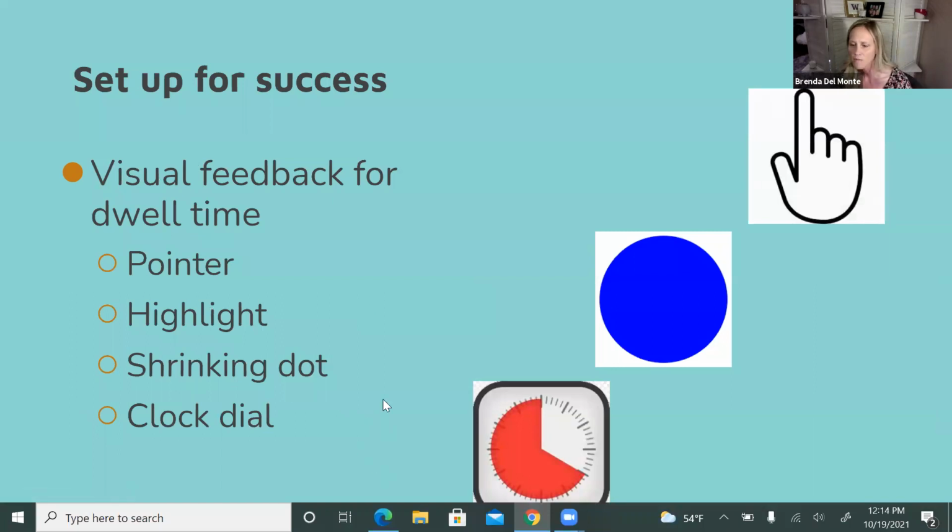Okay, so this device is programmed for eye gaze, the Accent, or is the eye gaze something that you added? Same for the Dynavox. For both of them, they were ordered with the eye gaze cameras installed. It's just like a Tobii Dynavox, but you have to order it with eye gaze.